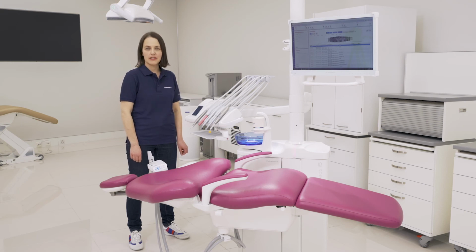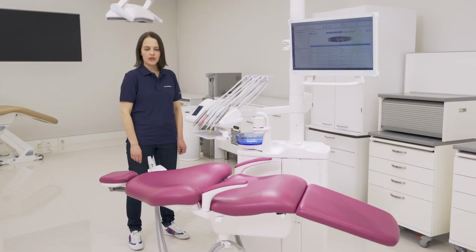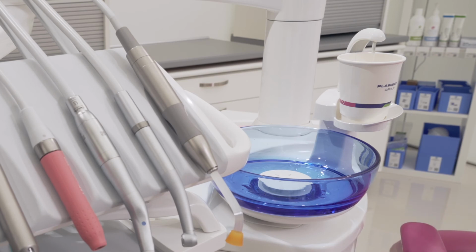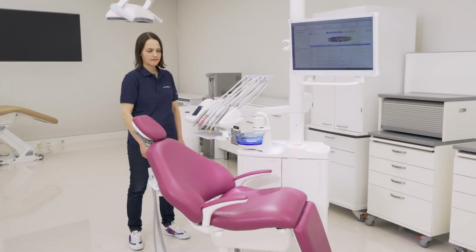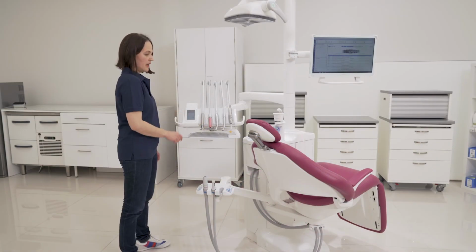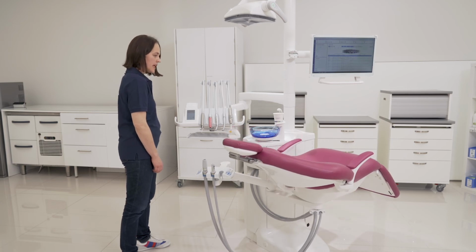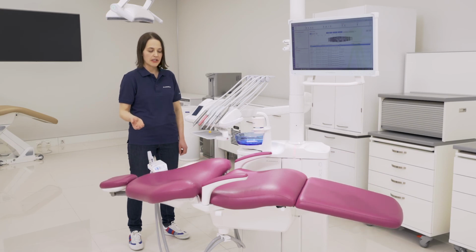There's a rinsing position which works so that when you press here, the chair goes to upright position, the cup filling starts, and also the bowl rinsing starts. When you press again, the chair goes to the previous position and the bowl rinse starts. And this provides an easy way to go between the treatment position and the rinsing position.